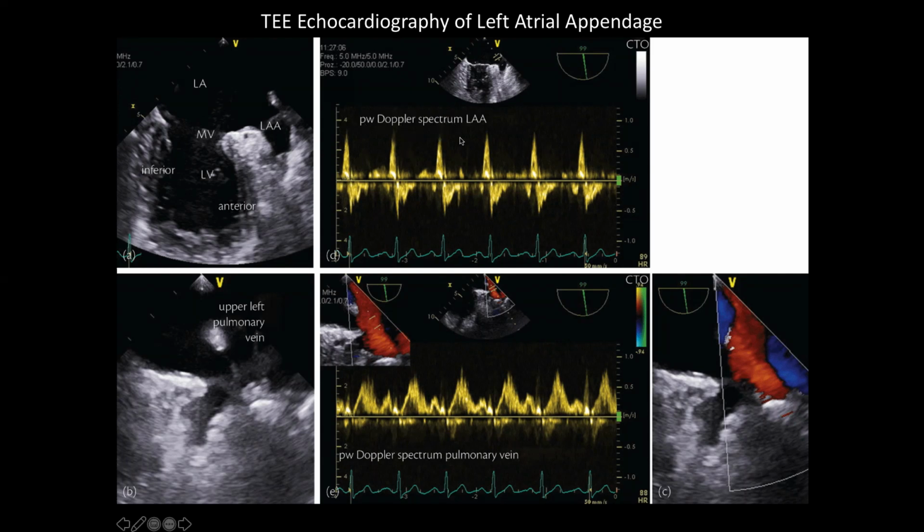So now we're looking at the Doppler spectrum. Remember the brightness of each one of these. This is time, right? And these are the heartbeats here. So time. Along each line here, I have a function, a spectrum with peaks that give you the power or the amplitude of the velocity component, right?